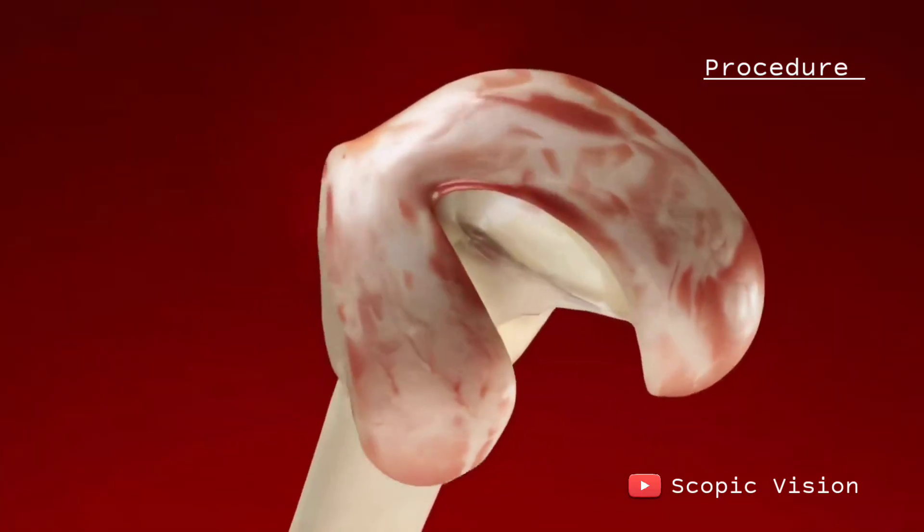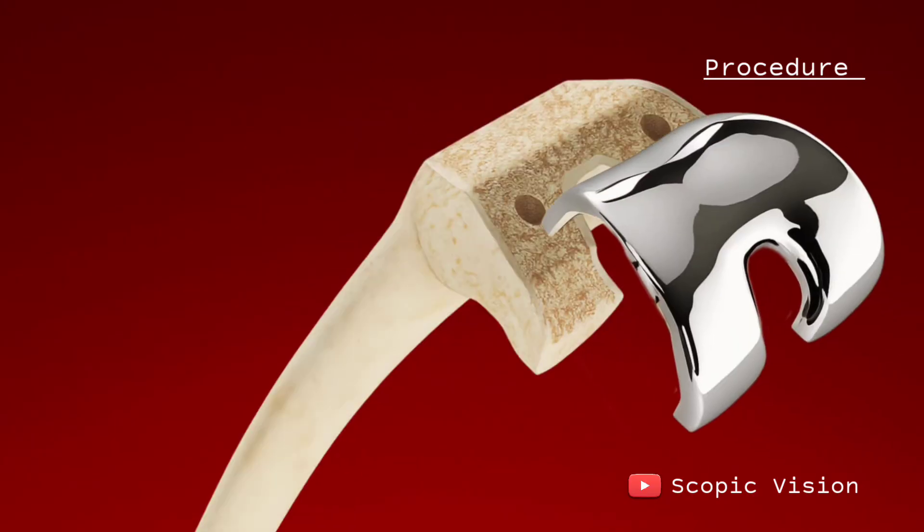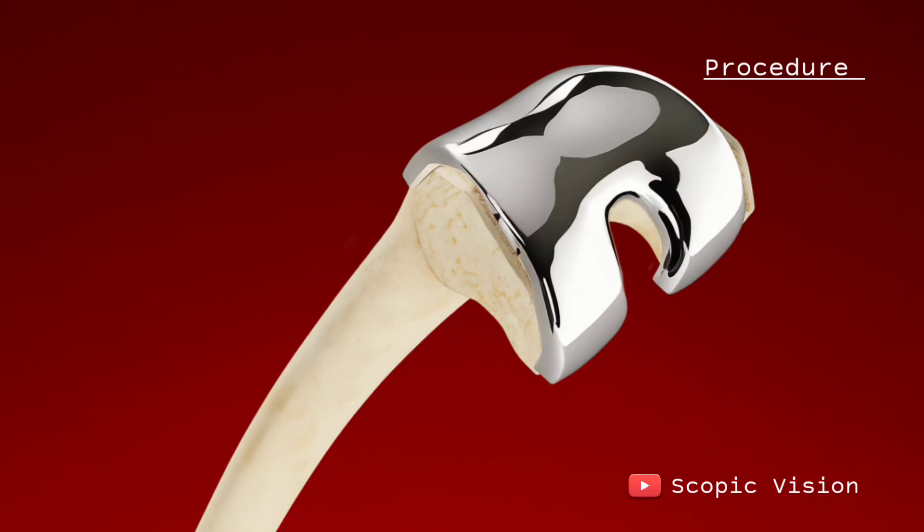First, they trim away the damaged surfaces of your thigh bone, cutting it at precise angles using special guides. A metal femoral component is then fixed onto the end of the femur, either with bone cement or without, depending on your case.